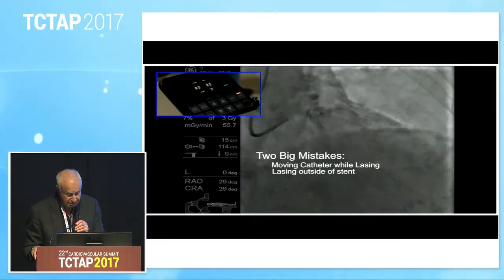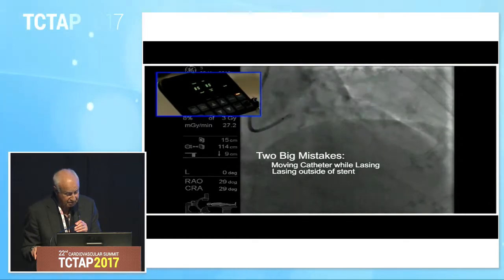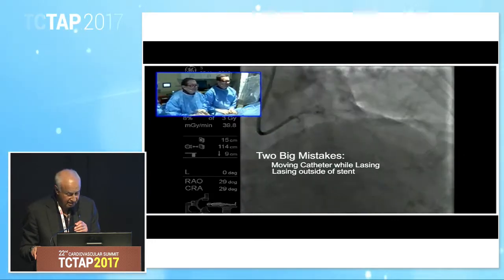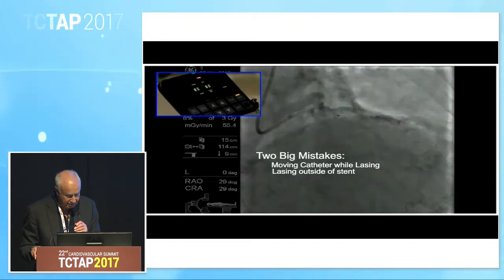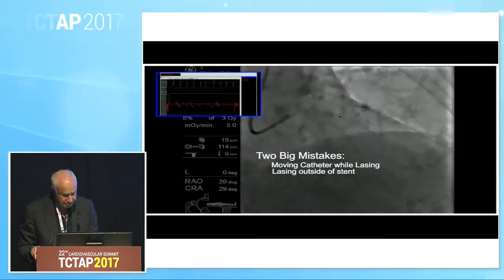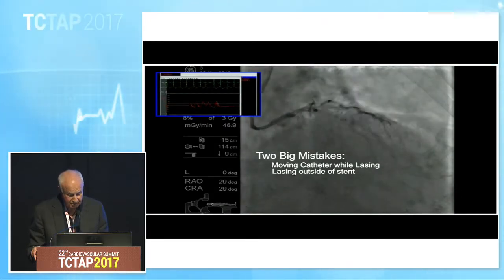All right, I'll try to narrate this. I was on the panel moderating this case and explaining what to do. But the problem is that the usual excimer laser technique is to advance the laser 1 millimeter a second during lasing. And that's not the technique for this procedure. You need to leave the catheter right in the middle of the stent and not move it when you're lasing. And the last thing you want to do is to lase outside the stent. So you'll see at the end this catheter goes distal to the stent. John Hodson was moderator at the time, and he mentioned that was not a good thing to do.